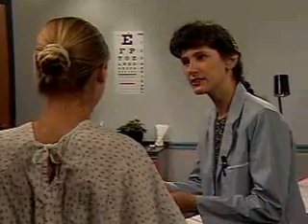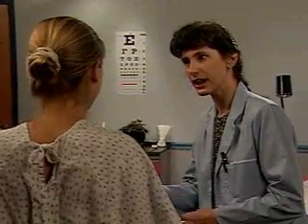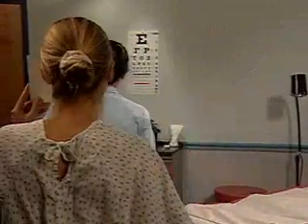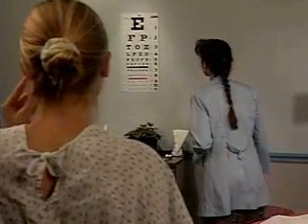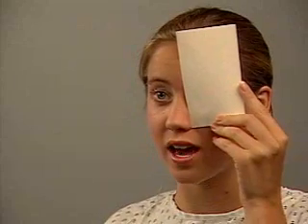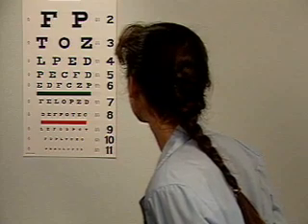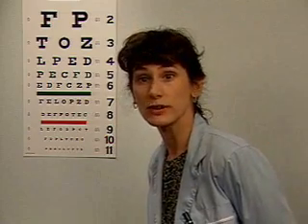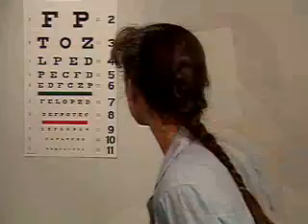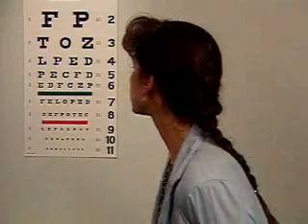Take this card and cover your left eye and read the smallest line possible. Note the visual acuity printed at the side of the line on the eye chart. Now try to read the next line. Then repeat the test on the other eye.